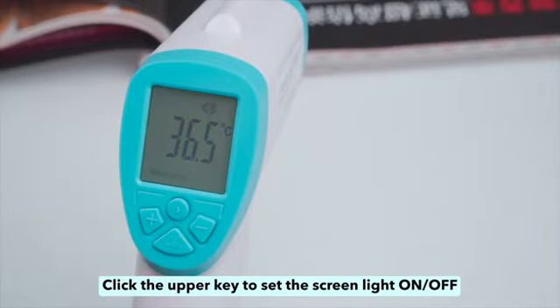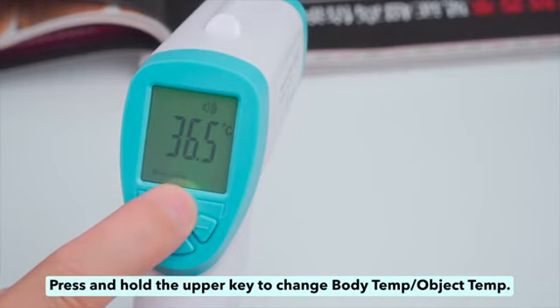Click the upper key to set the screen light on or off. Press and hold the upper key to change between body temperature and object temperature mode.